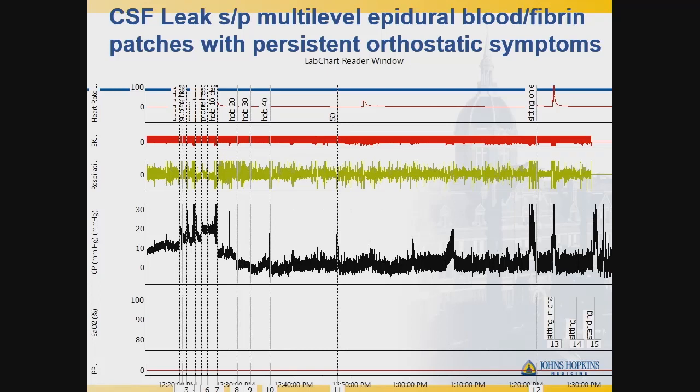We referred her to the headache center. She got Botox, and she was remarkably better. If we hadn't directed her that way, she would keep getting scans, keep getting patches. So here, continuous ICP monitoring was helpful to us in directing her to get the appropriate care.